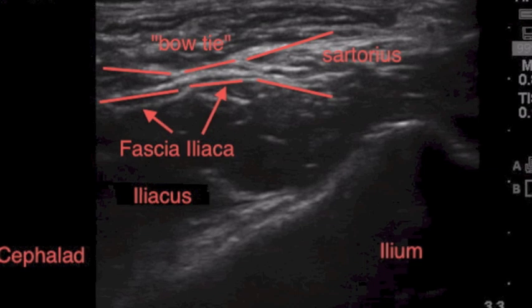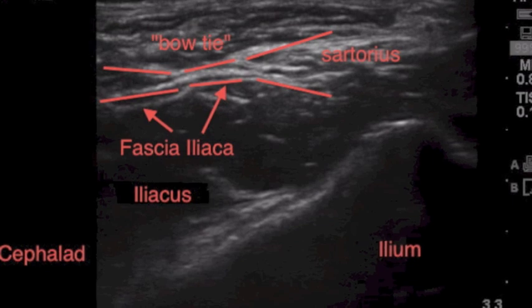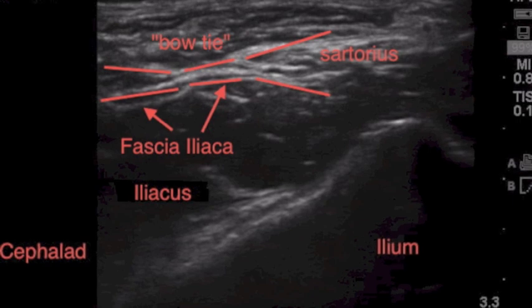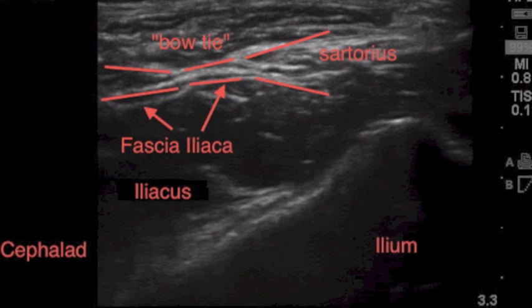In this photo caption of the block we're going to show you on the ultrasound, I've labeled some key structures so that you will be able to perform this block at your own institution. The left side of the screen is cephalad toward the head, thus the right side is caudad. The key structure to identify is the fascia iliaca plane, which sits just above the iliacus muscle. It is essential to inject your local anesthetic just underneath the sartorius, labeled to the right side of the screen, and under that fascia plane just above the iliacus muscle to achieve an effective three-in-one block.